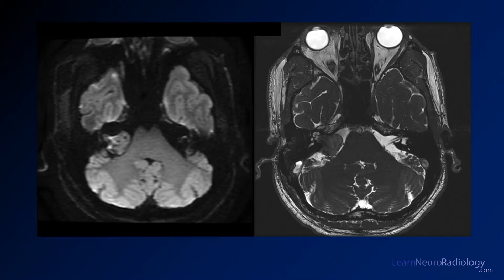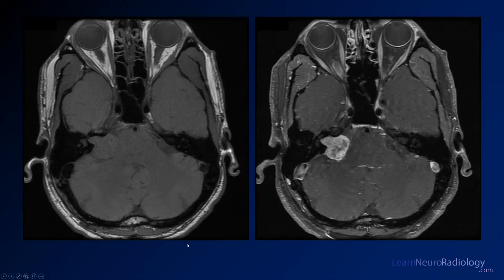Here you see the images. There is a mass in the right IAC — a pedunculated or mushroom-shaped mass coming out of the IAC. On T2 you can see it involving the IAC, with some expansion of the porous acousticus and a significant portion extending into the cerebellopontine angle. On the pre-contrast images it's very close to gray matter intensity so you don't see a lot, but on post contrast you see avid enhancement. It's pretty homogeneous but there are some areas of central low intensity, likely representing cystic degeneration or necrosis.